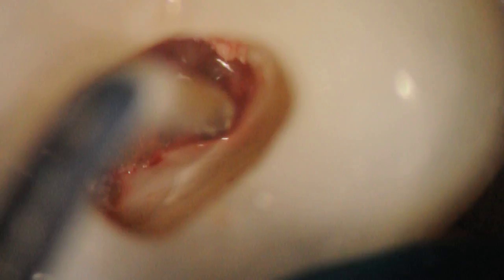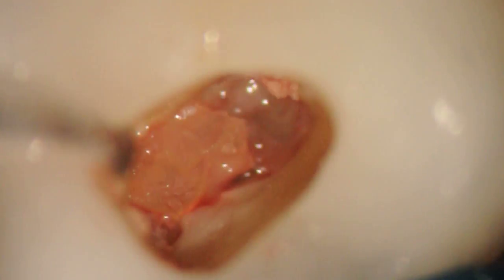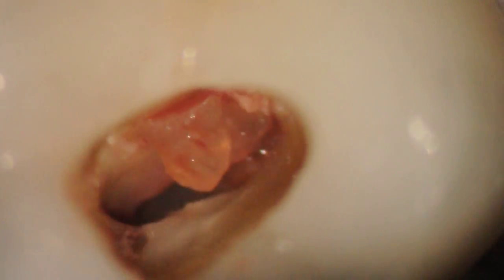It's all pulp stone there, which means it's really irritated. It's all pulp stone — it's just calcium. It's calcium, it's huge. Diamond rock inside.